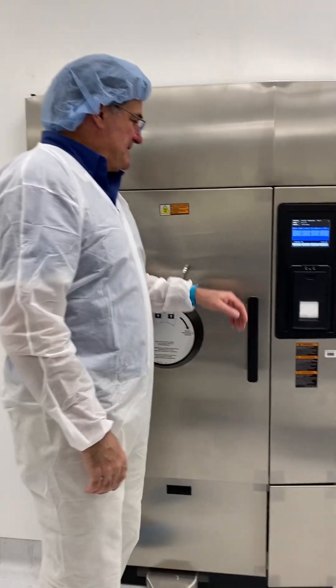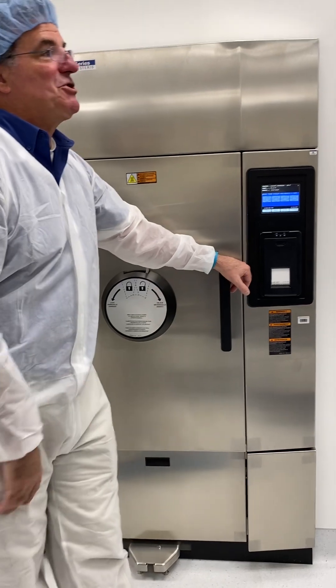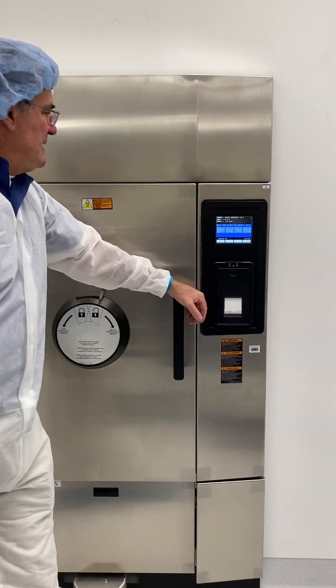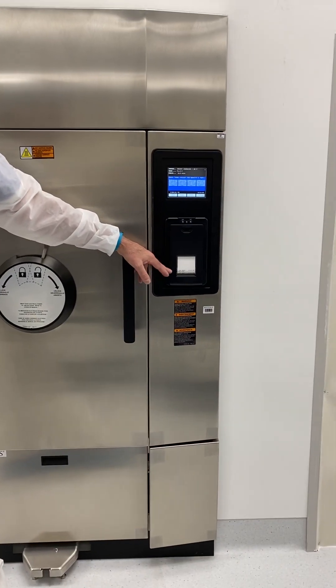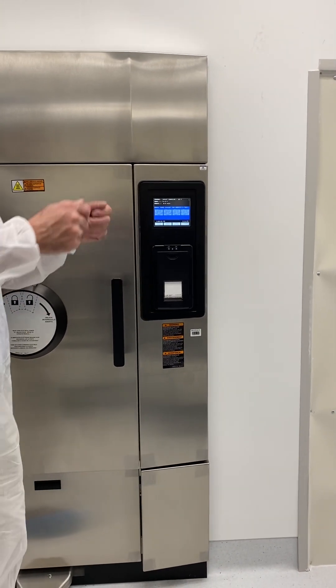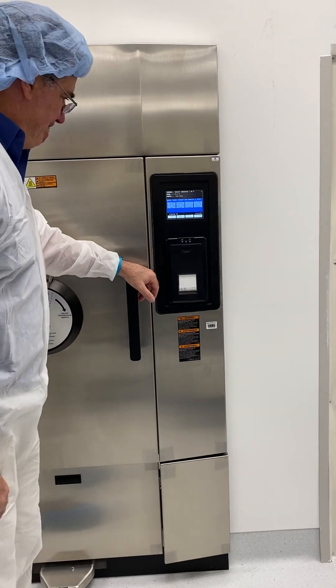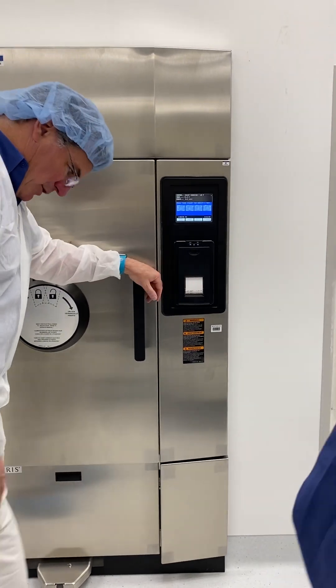This is called a thermal printer — almost like the old fax machine, but the writing won't disappear for 20 years. You know how fax machines after a year you could barely read them because it was thermal paper? Well, the thermal technology has really come along since then.